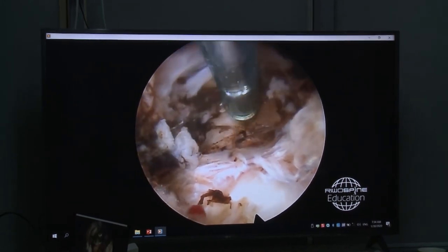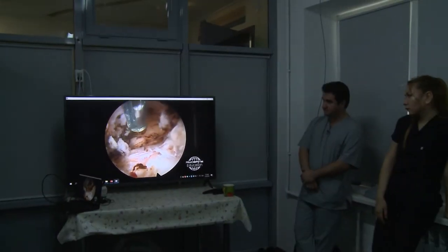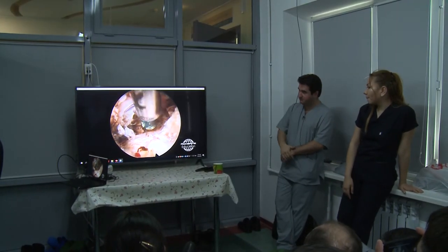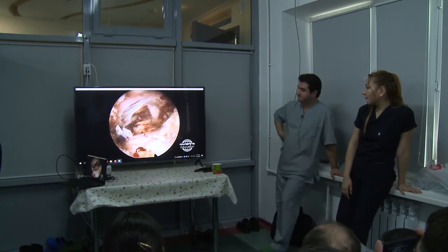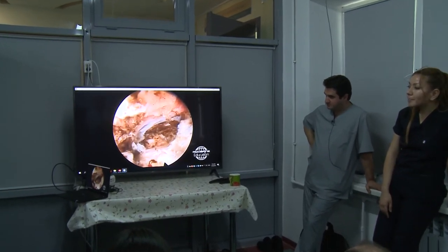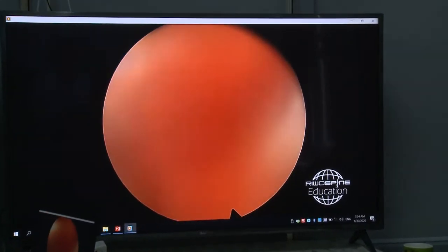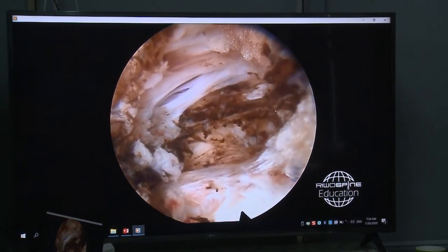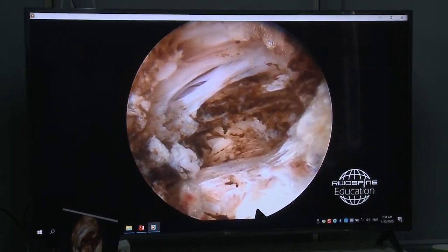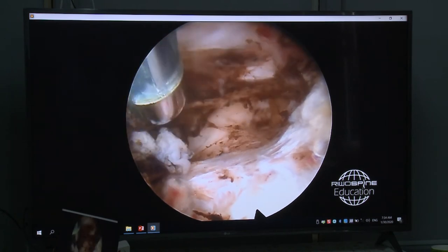You will see that. You see here comes something in our way, directly in front of us. If you go a little bit cranial, posterior, sorry, you will see it. Here's something in front of us, so just prepare a little bit better. I'm going with a cannula a little bit more.